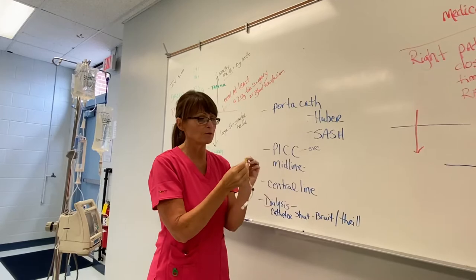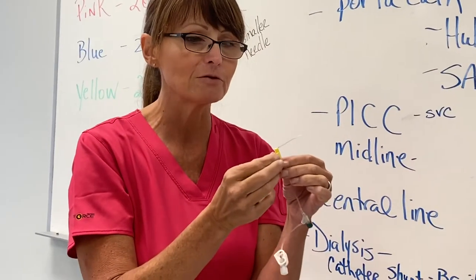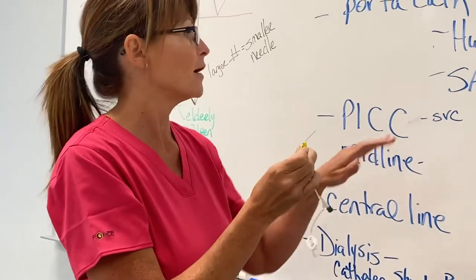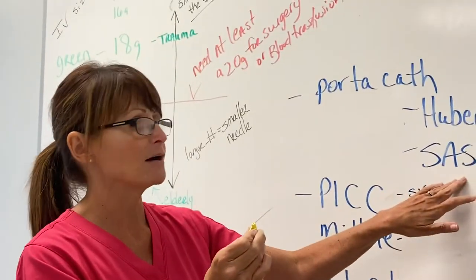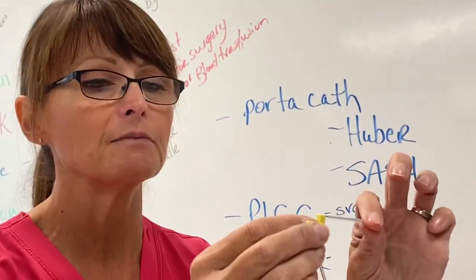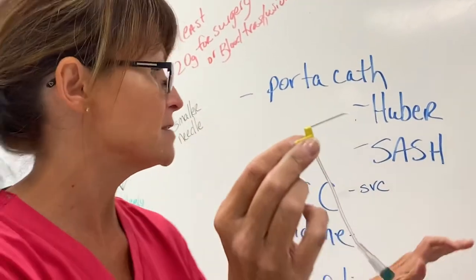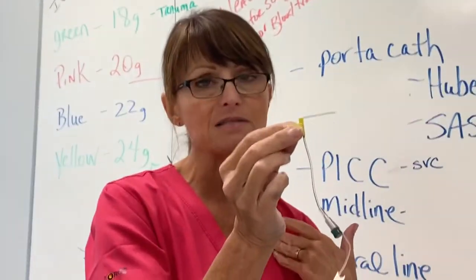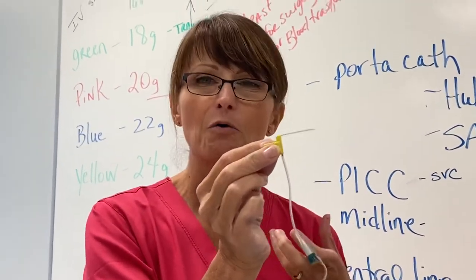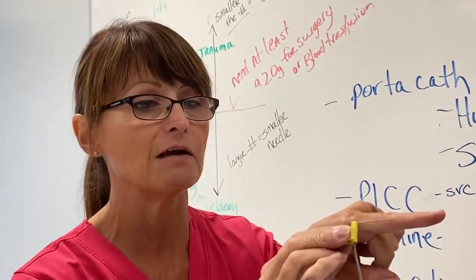The special part of a Huber needle — and accessing a port-a-cath is one of my favorite things — is that it looks like a hummingbird. Here's your needle. That's a big needle. The nurse would look and see what size they need because if you have an obese patient, you may need a needle that's about an inch and a half long. Some may be shorter if the port isn't as deep.